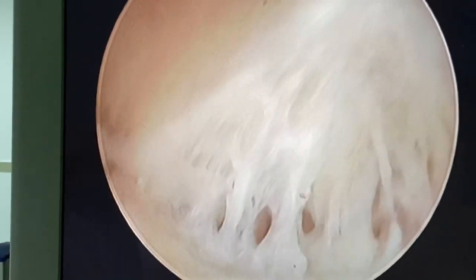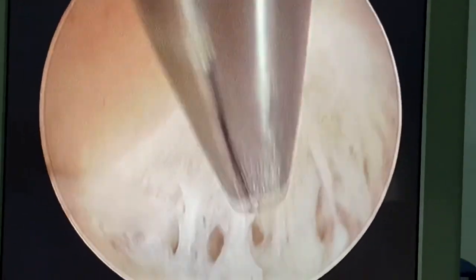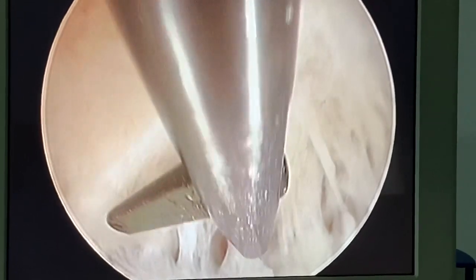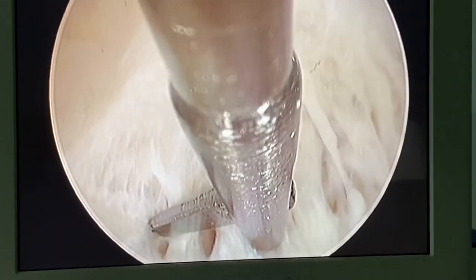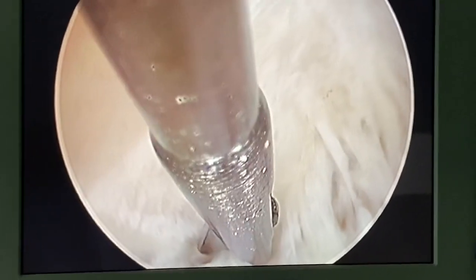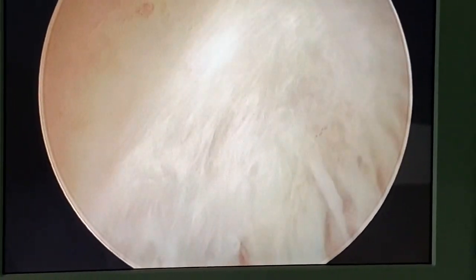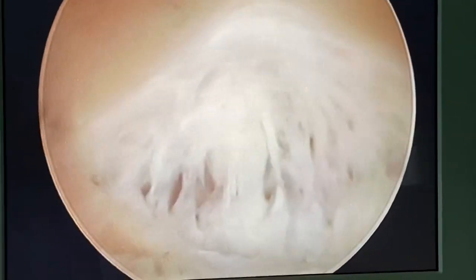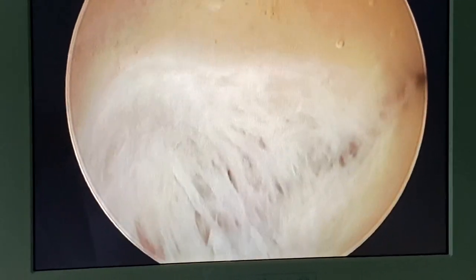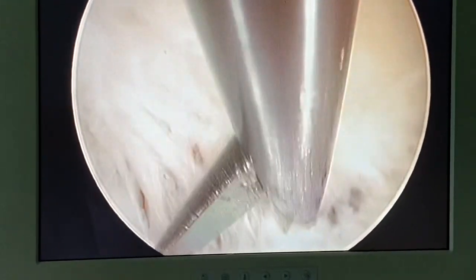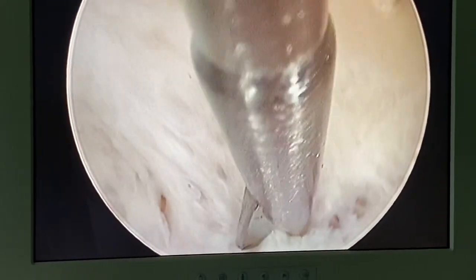More tips: when you push the scissor in, you have less fluid pressure; when you pull the scissor out, you have more fluid pressure. Be careful not to cut too much — the fundus should not look like an umbrella.